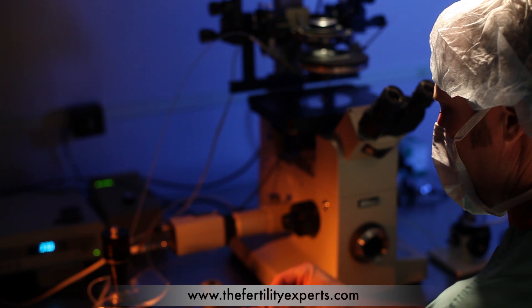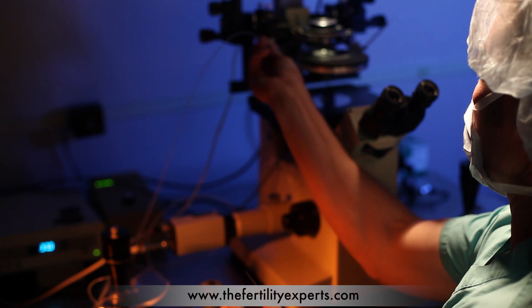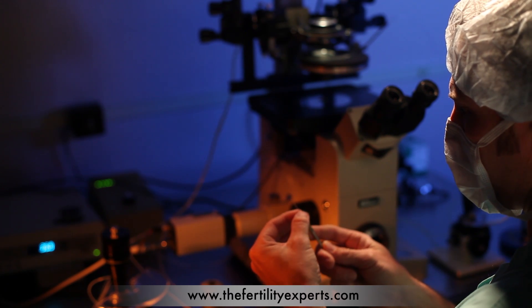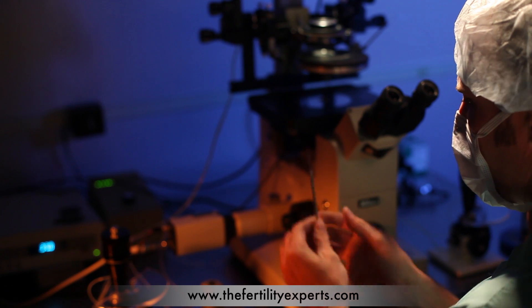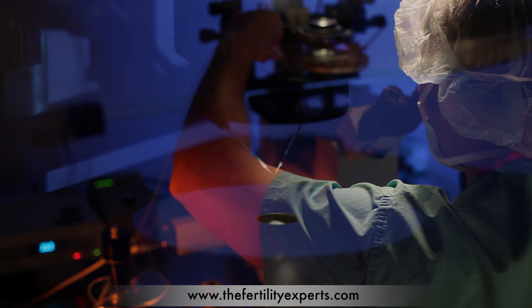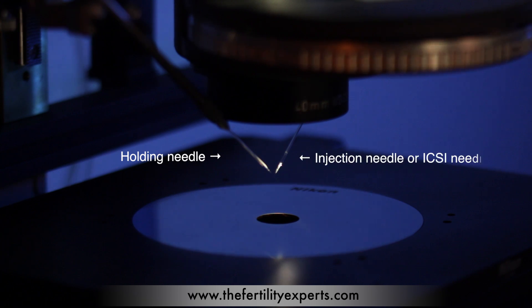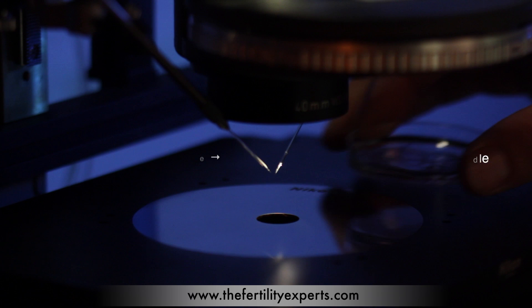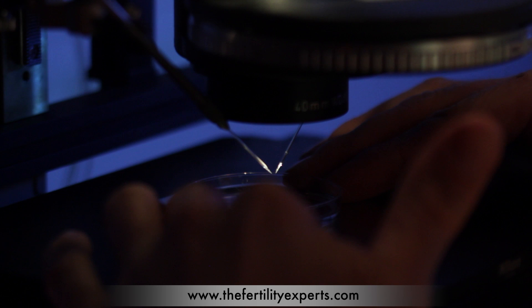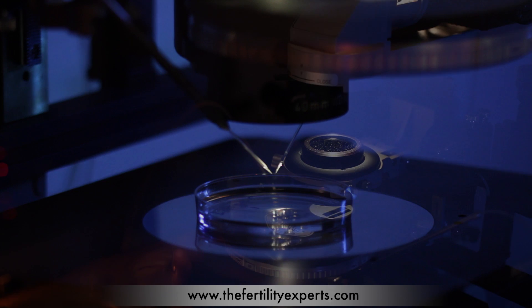Now let's take a look at the ICSI procedure. Prior to preparing the microscope, the oocytes have been stripped of their cumulus and granulosa cells, and the motile sperm has been separated from the non-motile sperm and washed. We begin by setting the needles into the scope — the holding needle on the left-hand side and the injection or ICSI needle on the right. Prior to the procedure, a culture dish was prepared with media and overlaid in oil. This ICSI dish is loaded with both the spermatozoa and oocytes and placed in the center of the microscope's heated stage.